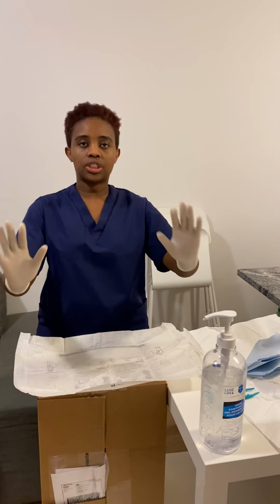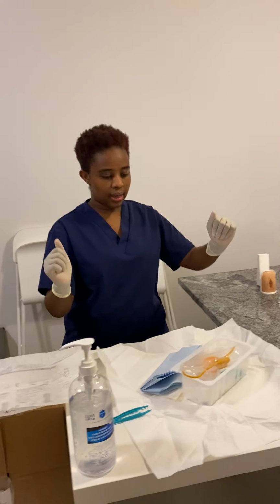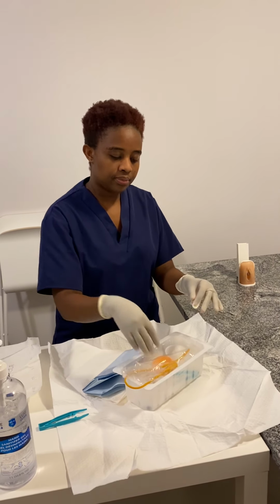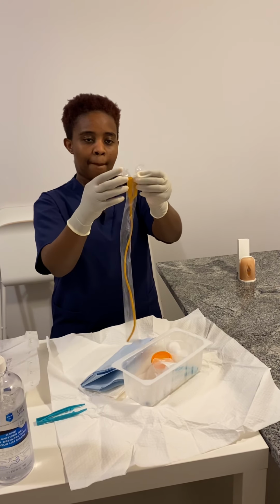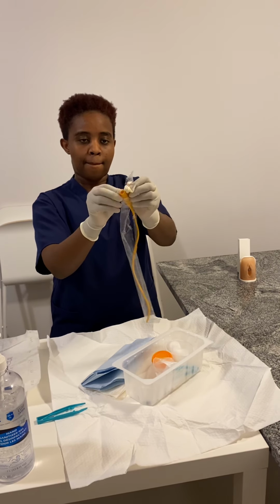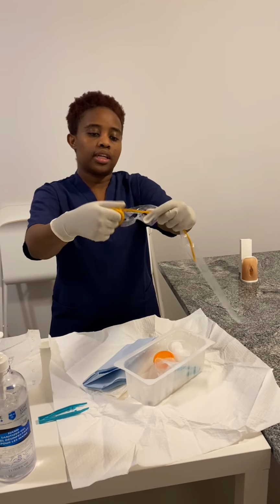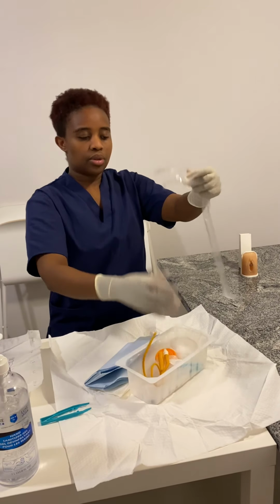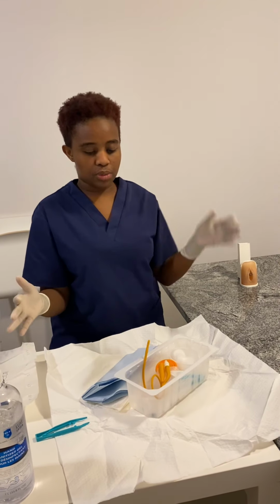That means that I can touch only sterile equipment. So now I'm going to open my catheter. And I have to make sure that when I'm opening my catheter, I'm coiling it to avoid any air exposure. And then I'm going to add it in the tray. Okay, I'm going to dispose of that.